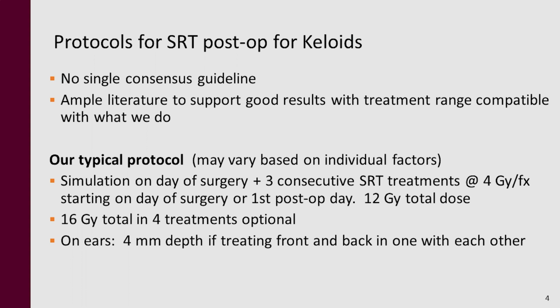Today I had a woman who had a very, very large keloid on the top of her ear. It was very deep. And I think I got almost all of it out, but it's still a little bulky. For her, I'm going to go ahead and do 4 treatments rather than 3. There's very little additional damage possible with 4. These are pretty low doses. So in this particular patient, I'm going to do a 4th just to give me a little extra reassurance that it's going to work.